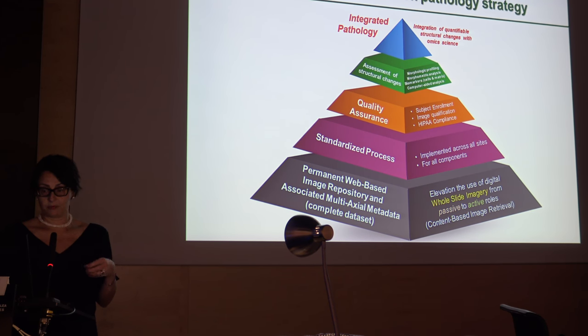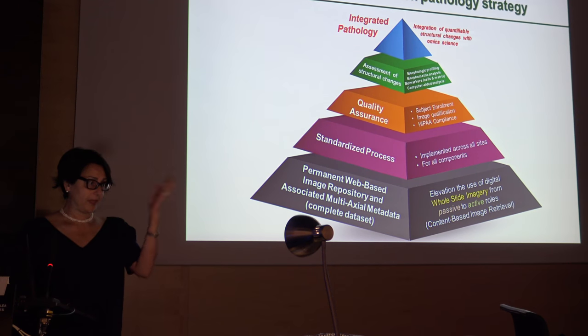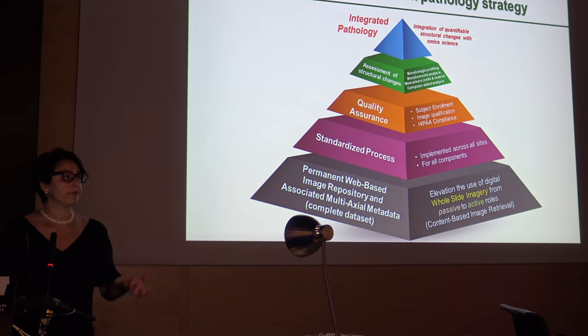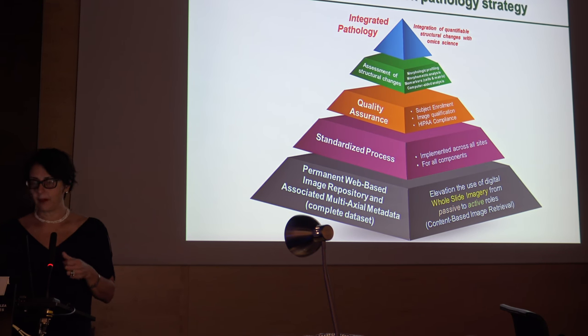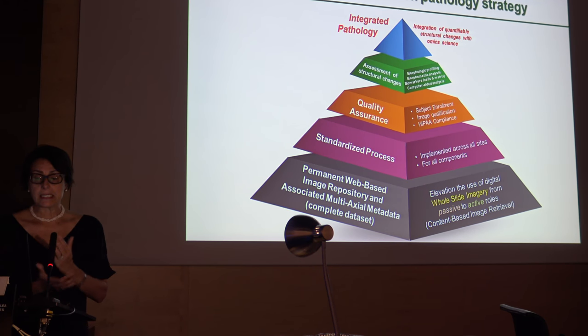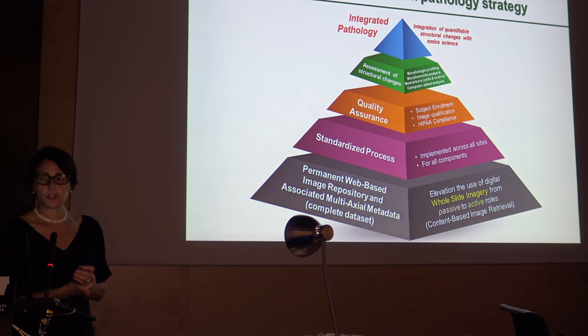What does it mean, active role? That you can do content-based image retrieval. So you don't only look at the biopsy and say what you want to say, but you can have the computer retrieve information from the image itself. It allows you to implement standardized processes and quality assurance.